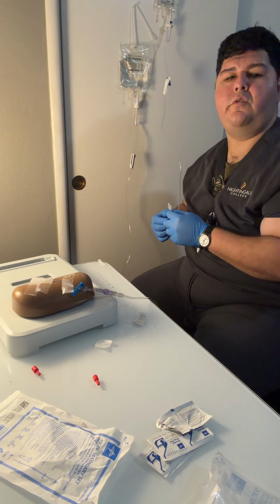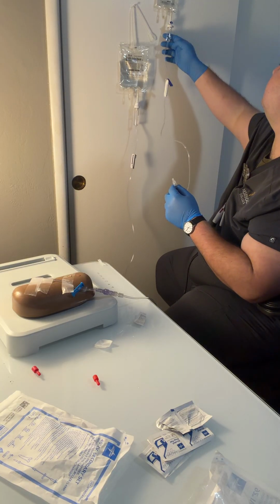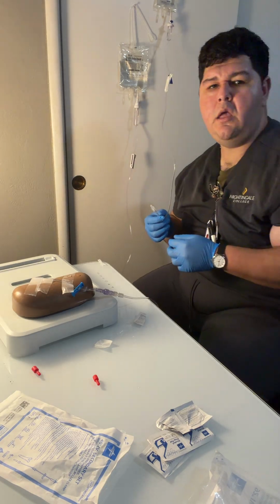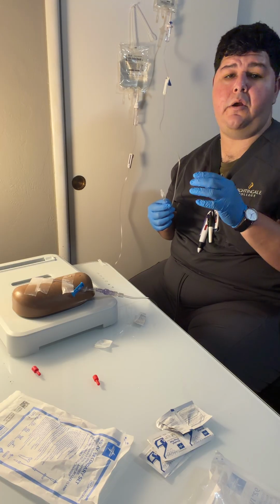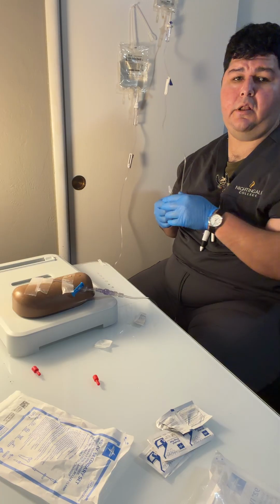And then we're going to go ahead and squeeze our drip chamber to half full. And then we're going to slowly prime our line by slowly opening the roller clamp so that no air comes in, but it also allows the air and the bubbles to exit out of the line.